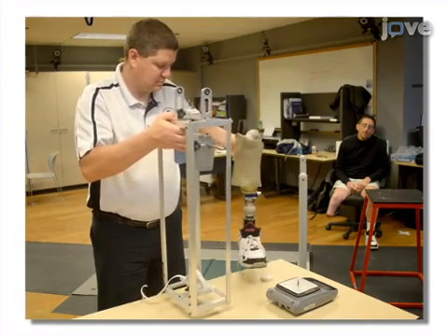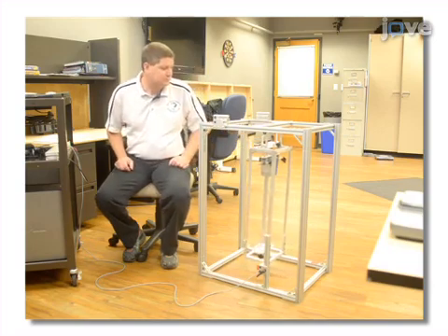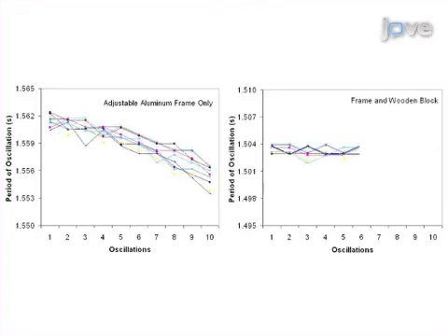Next, the prosthesis is removed from the cage, and the reaction board technique is used to estimate the center of mass location of just the cage. The final step is to measure the period of oscillation for the cage alone. Ultimately, this inertial measurement system was validated using known geometrical solids, such as a 4x4 wooden block. Results from these experiments are presented in Appendix A.